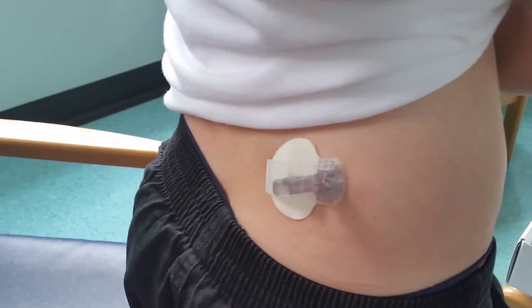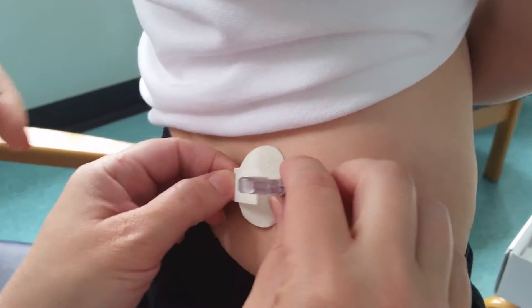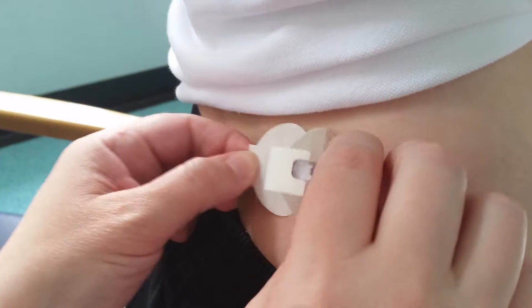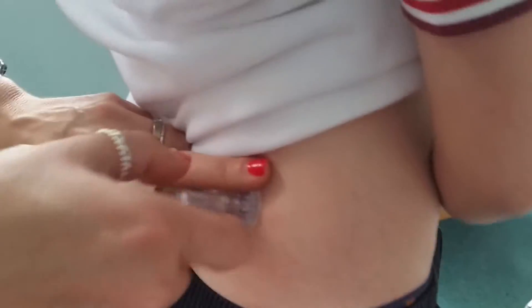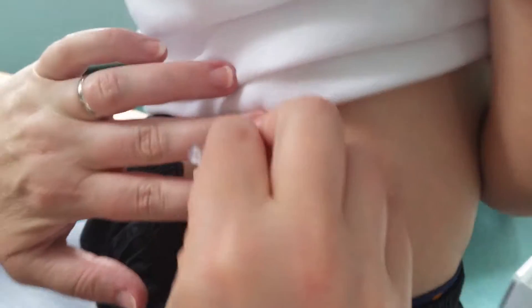There's a little bit of sticky there. You're just going to support that and slide the sticky that way, keeping this bit nice. Pull that bottom bit that way — perfect. Now support the sensor and pull it directly out. No wiggling, just directly out — perfect.